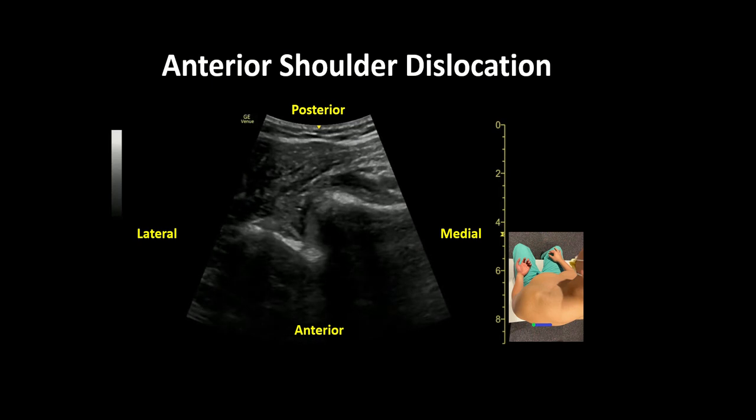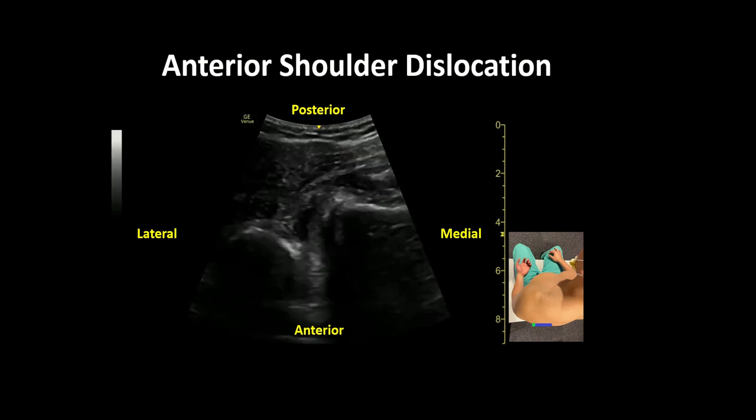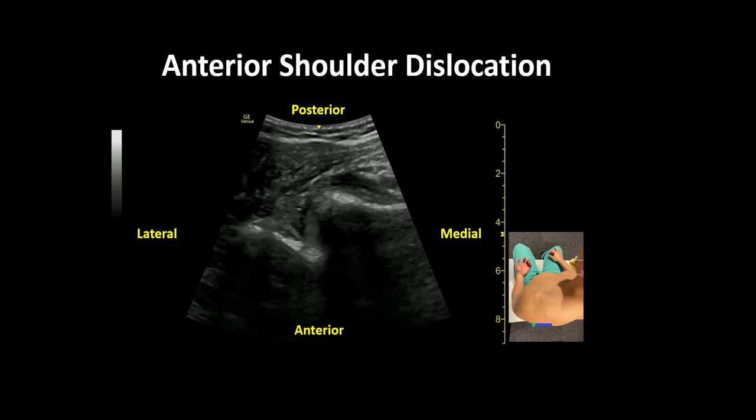This is an ultrasound clip demonstrating an anterior shoulder dislocation in a patient presenting to the emergency room with shoulder pain after a fall.